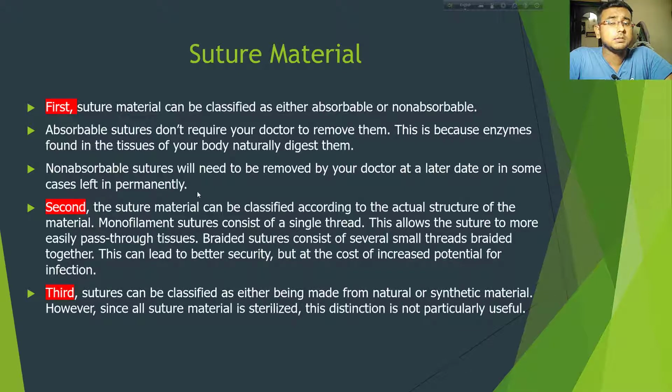Some suture material may need to stay for a long time for protection, like in herniorrhaphy, or mass closure of the abdomen. In that case, suture material like polydioxanone or PDS is used. Sometimes Prolene, a polypropylene monofilament, is used. That is also called non-absorbable suture material. Previously, many other non-absorbable materials were used, like nylon and silk, which are naturally non-absorbable suture materials.